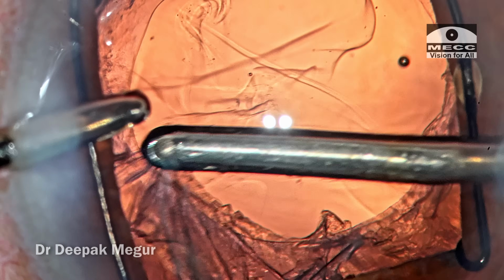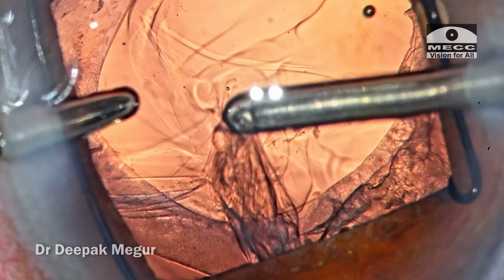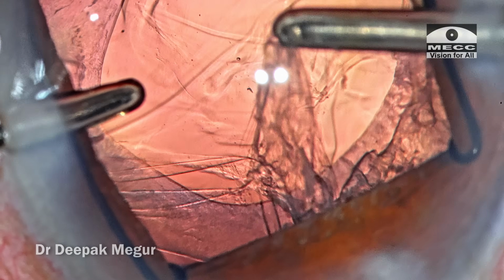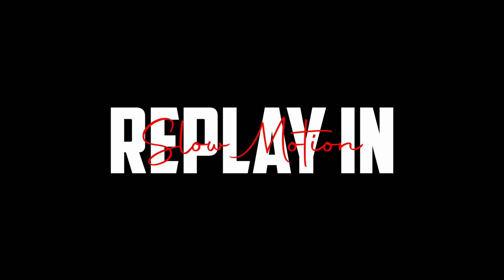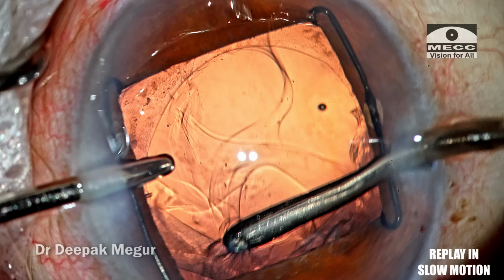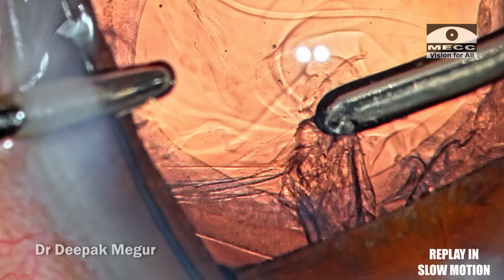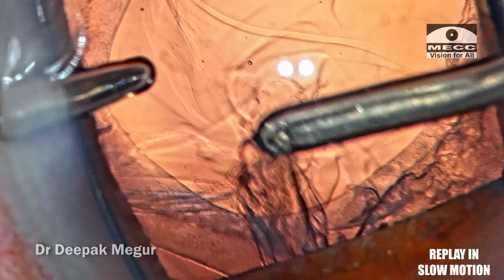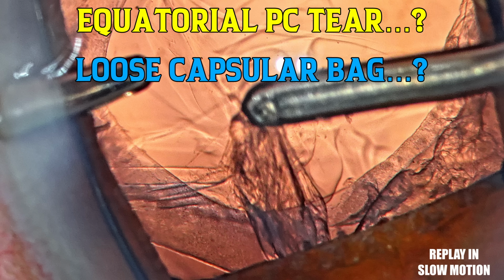As I'm removing this cortex, there's a momentary scare. I can see that the posterior capsule is coming along with the aspiration port, and it was scary. So let me replay and show you in slow motion how it looked. The cortex is being pulled out. Along with it, you can see the wrinkled posterior capsule is coming out. At this stage, I wasn't sure whether it was an equatorial PC tear or just the loose bag trying to come along with the cannula.